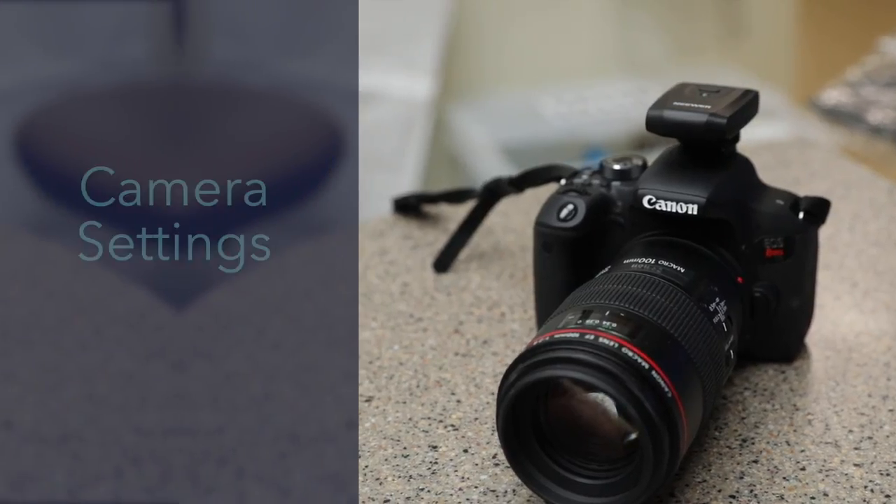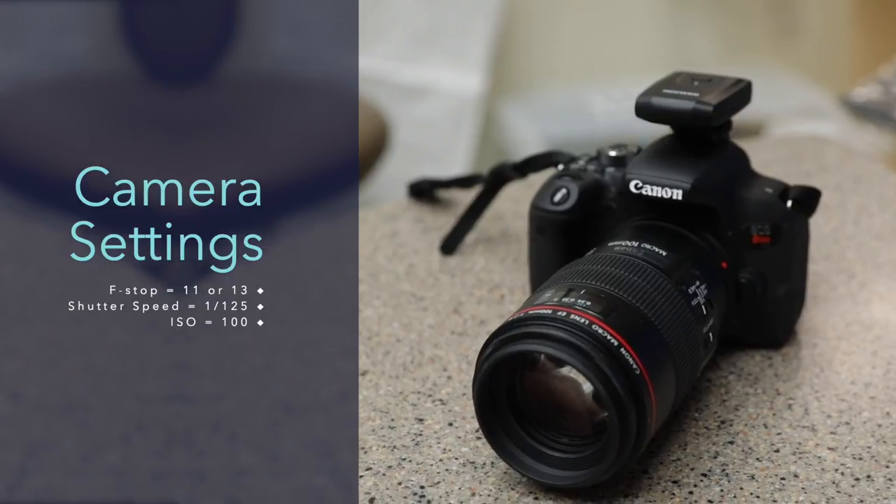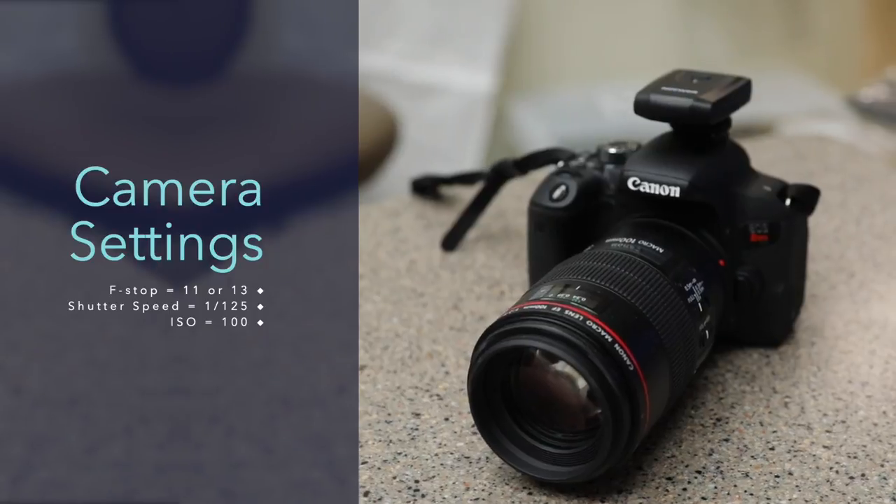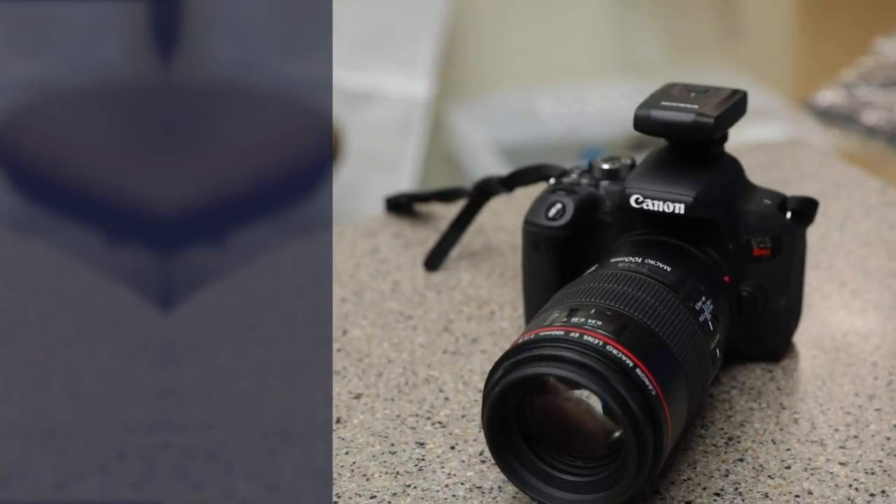On my camera, I adjust my f-stop to 11 or 13 and set my shutter speed to 1/125. My ISO is set to the lowest possible setting of 100.